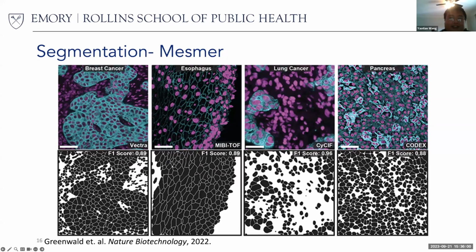Yeah, that's a really good question. One more comment, if I may. Dividing cells also have very atypical nuclei, and this is something that is in particular important if you deal with cancerous tissues. So that often requires taking sections from different directions in order to identify the frequency of dividing cells. So how do you deal with that? That's a really good point.